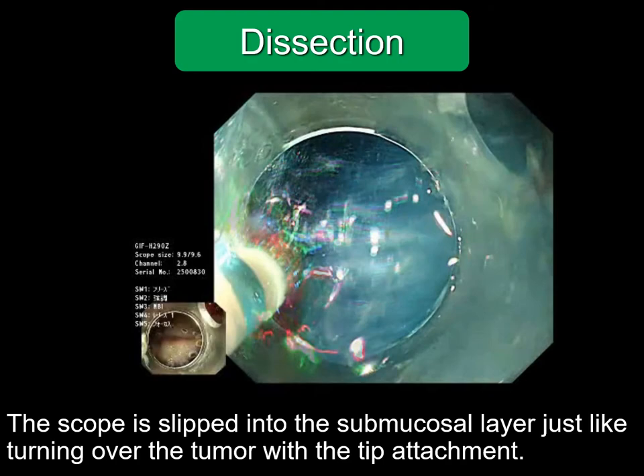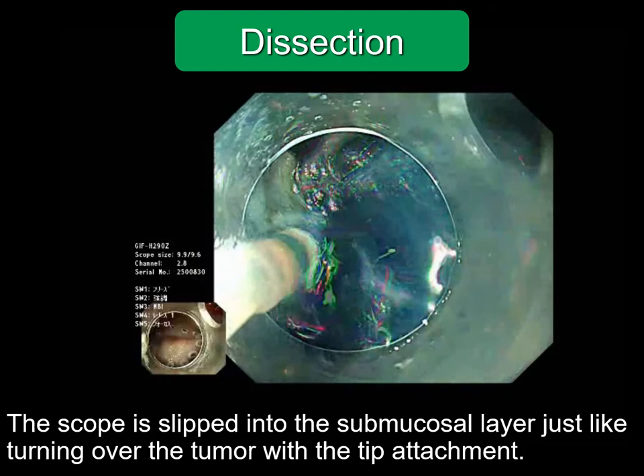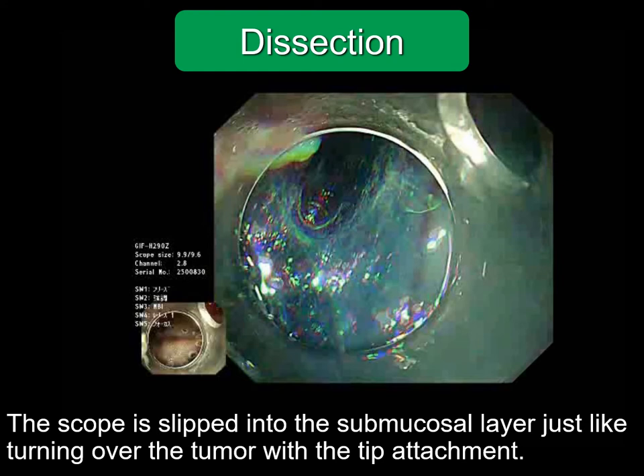If there is a blood vessel, move the knife slowly. If there is a thick blood vessel, recoagulation is applied using hemostatic forceps. Dissection should be ensured on both sides. If fibers of the edges remain, the region cannot be turned over smoothly. The region should be dissected with a clear visual field.